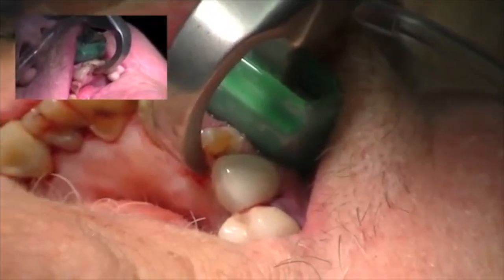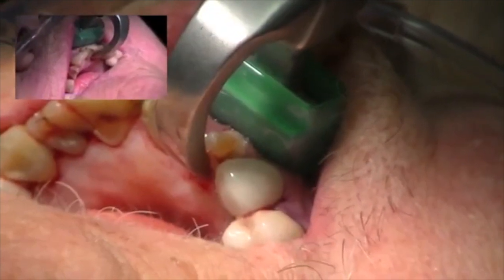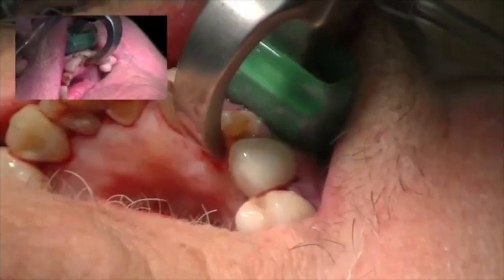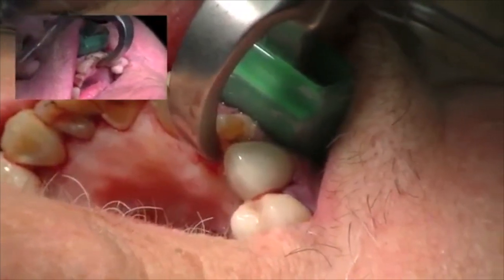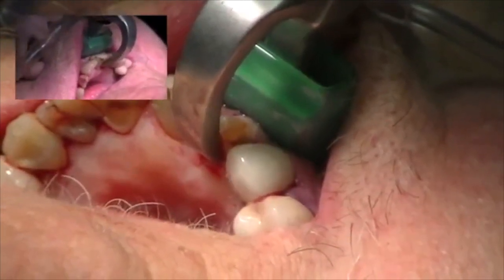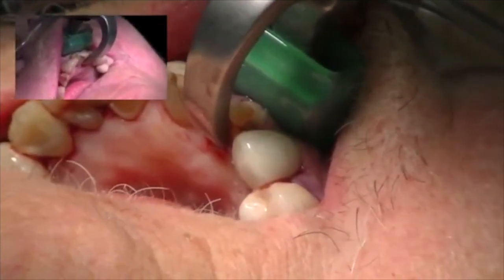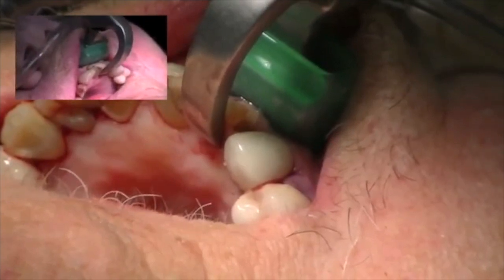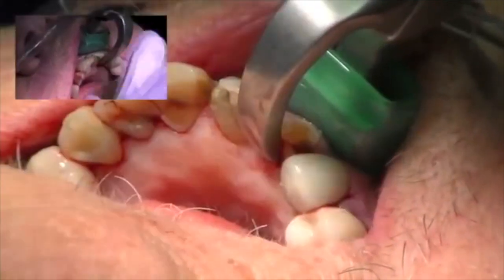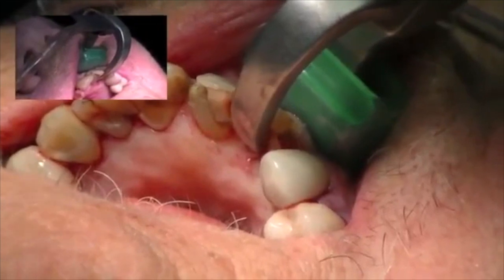We get a physiologic response where we get hyaluronidase breakdown of the periodontal ligament, and that breakdown will elevate the tooth out of the socket. We're not moving the tooth facially out of the socket — rather, the tooth is being lifted up and out of the socket. It may take two to three minutes to do that. You can see I'm using very little pressure, and you can see the tooth moving a little bit. Just take your time — as dentists we have a tendency to want to go fast.